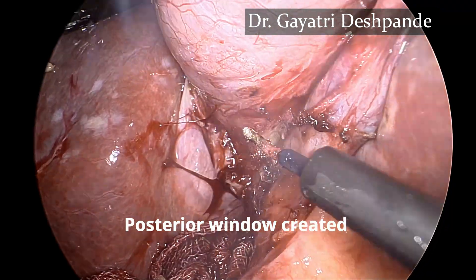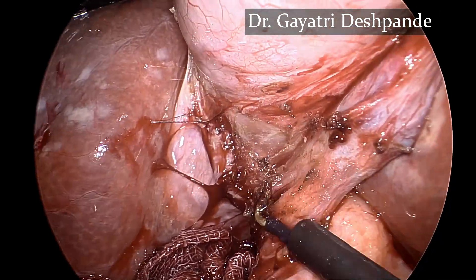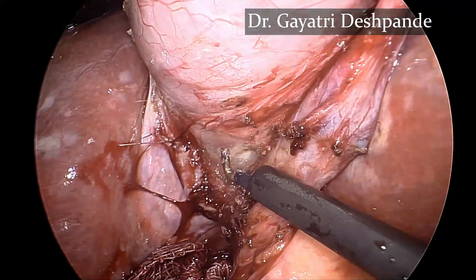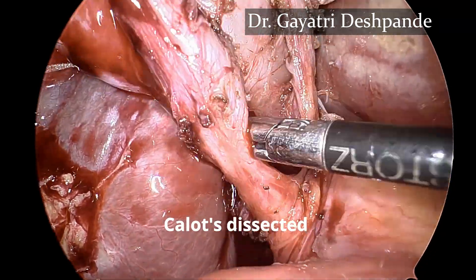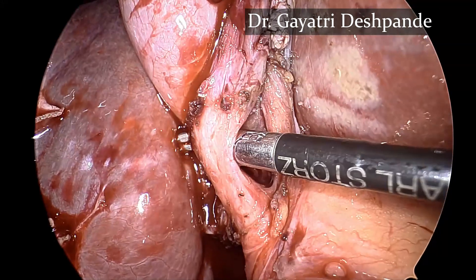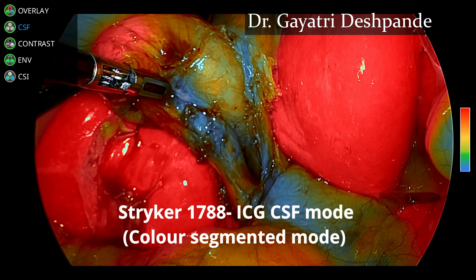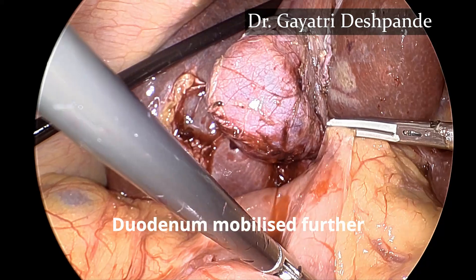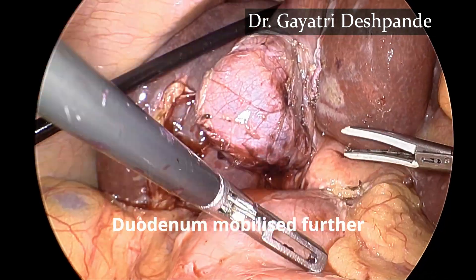The posterior window is now created using sharp dissection. Calot's triangle is completely dissected and the critical view of safety has been achieved. The anatomy is confirmed using the various modes of ICG and further dissection is continued with caudal mobilization.